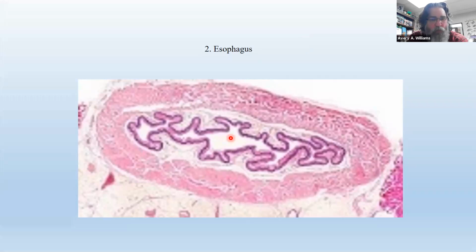Lumen, because like illuminate, it's where light comes through. This is a photomicrograph from light microscopy, a picture of something underneath the microscope, essentially. Wherever you don't have something on the microscope slide, you have more light shining through. Obviously, here where there's nothing, that's where most light is going to come through. So the lumen is the hollow part, okay?